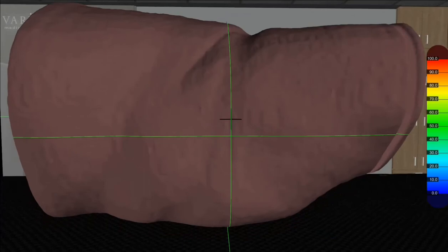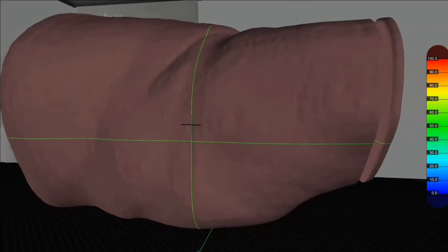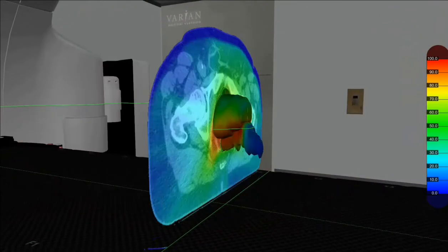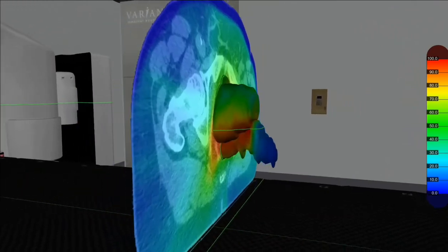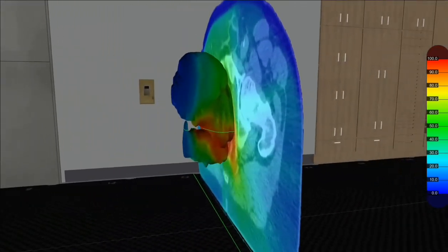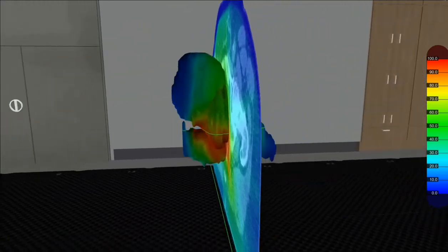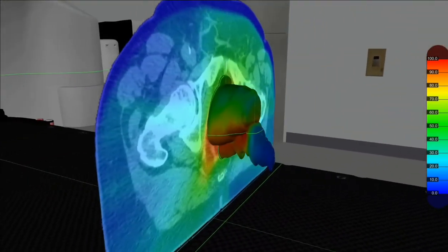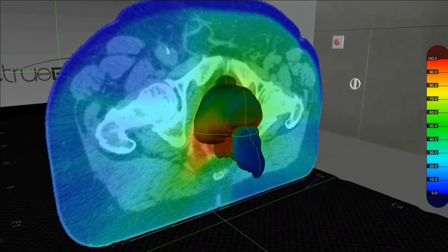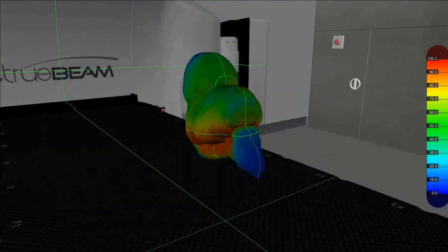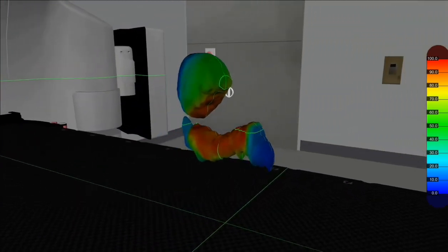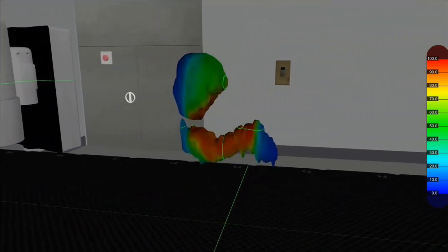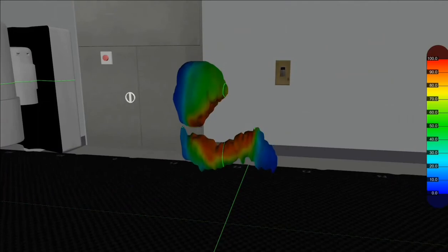Setup errors can be introduced into the system and the dose on the CT slices will reflect this error, allowing audiences to understand the importance of accuracy and the effect on dose should the setup not be precise. Doses can also be shown on surfaces, making the effect of the error more prominent and highlighting the importance of following protocol — especially effective in patient education prior to the start of radiotherapy.